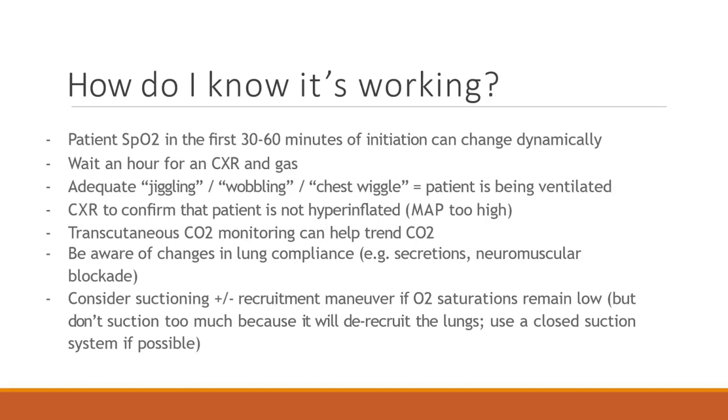We want to use the TCOMs with these. We want to be monitoring. Of course, we'll get blood gases as well, and most of these patients, of course, will have UACs, we would hope.